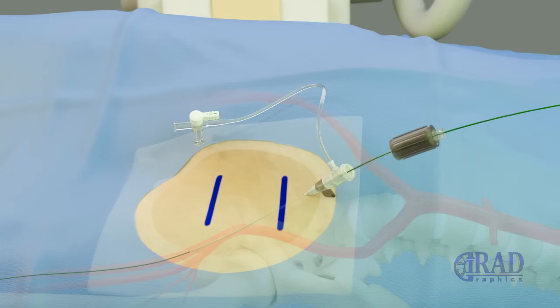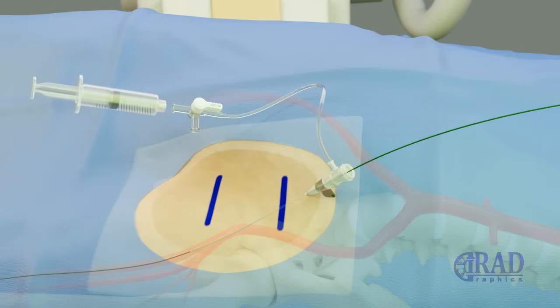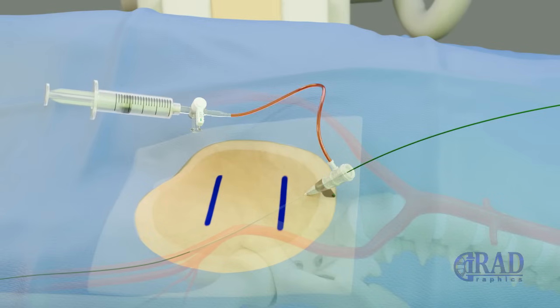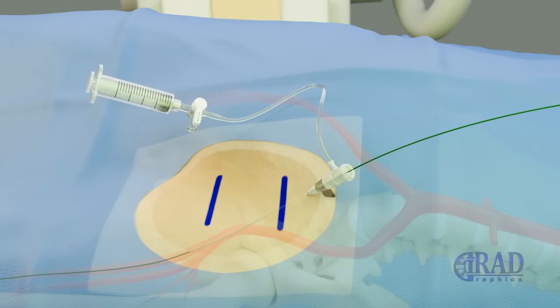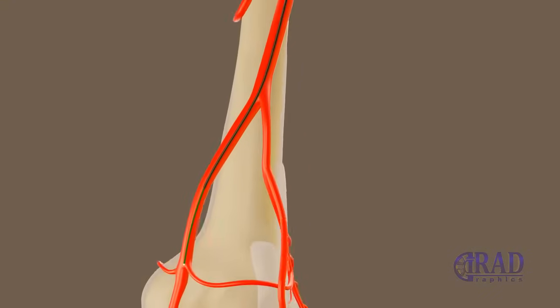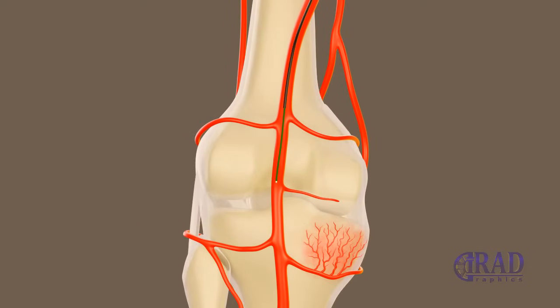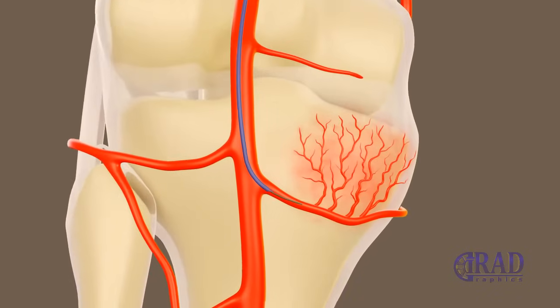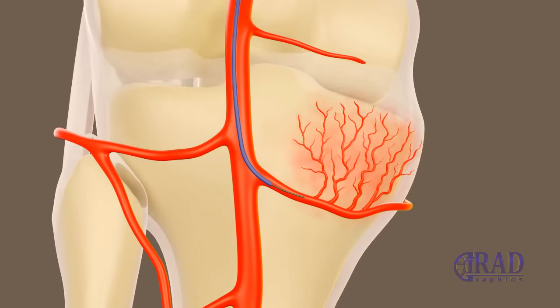The dilator of the vascular sheath is removed, and the sheath is aspirated and flushed with heparinized normal saline. An angled catheter is advanced over the wire, through the sheath, and into the distal superficial femoral artery near the adductor canal. The wire is then removed and an angiogram is performed to identify the genicular arteries contributing to inflammation in the knee joint. A combination of microcatheter and microwire is advanced through the base catheter to select the target genicular arteries.